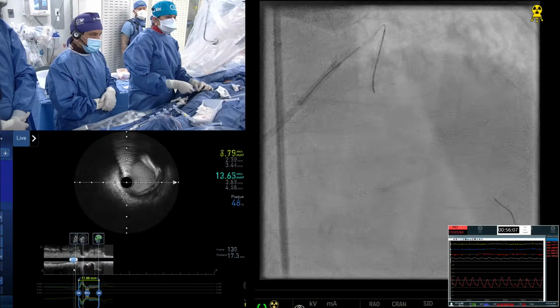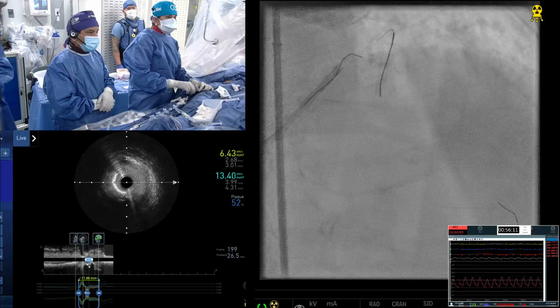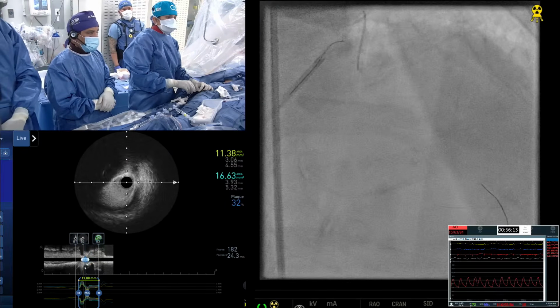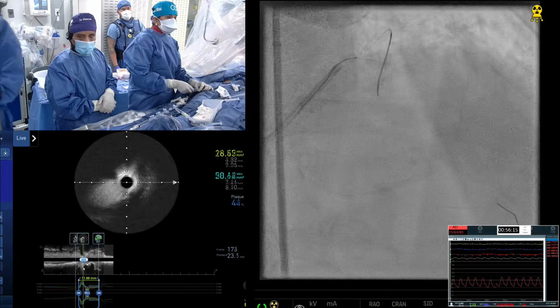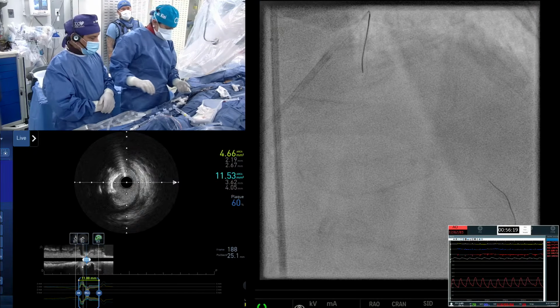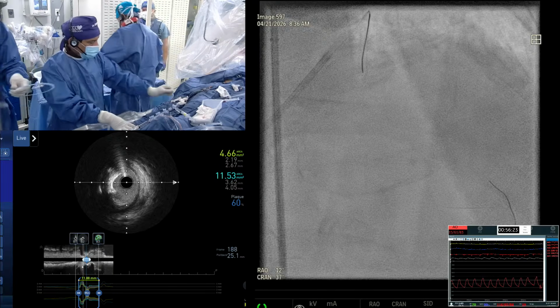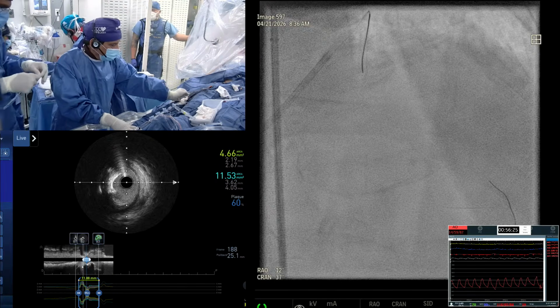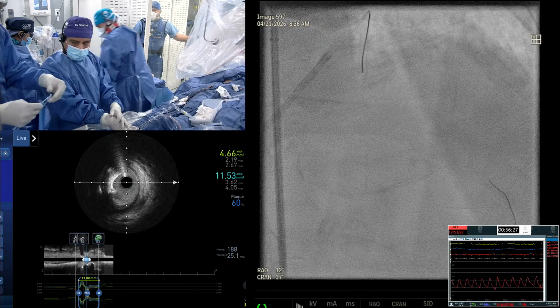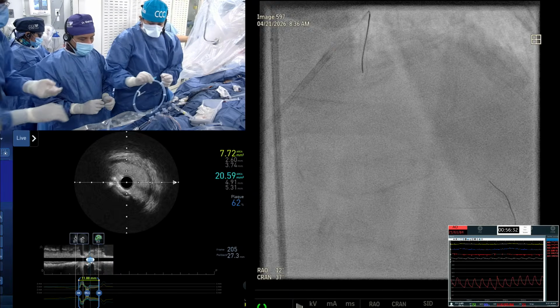The question was, we want to shape it a little more. Run through is a better wire. Okay, get another run through. Keep it if you need it. Clean. Yep. So we'll use a run through.